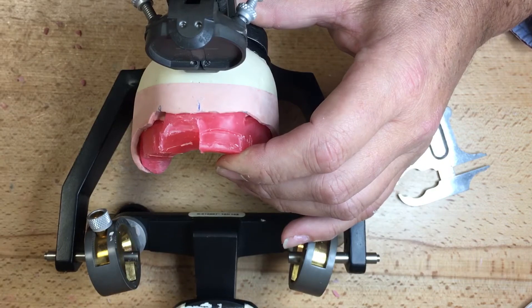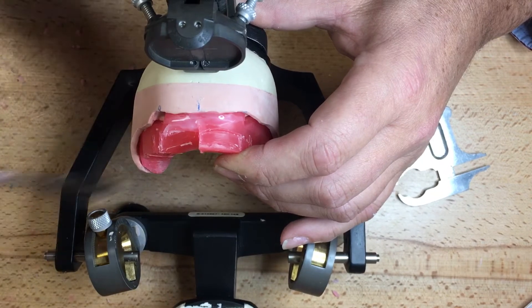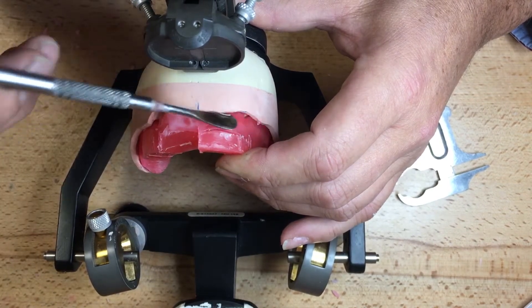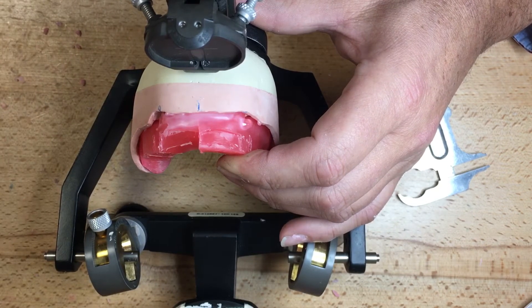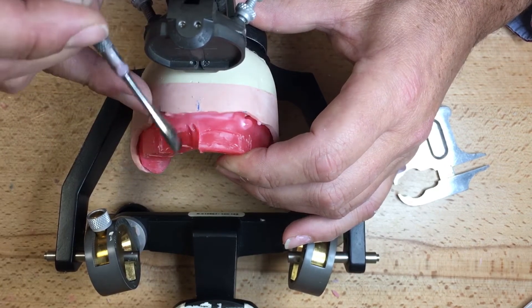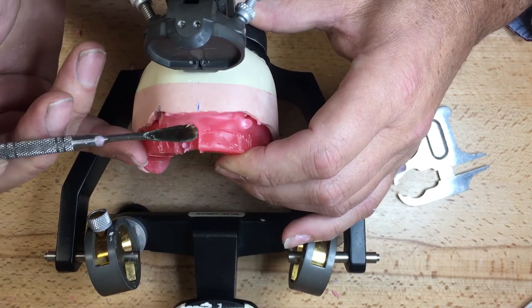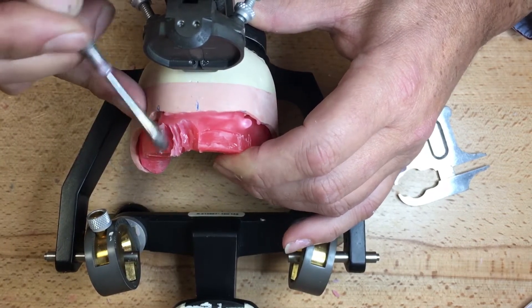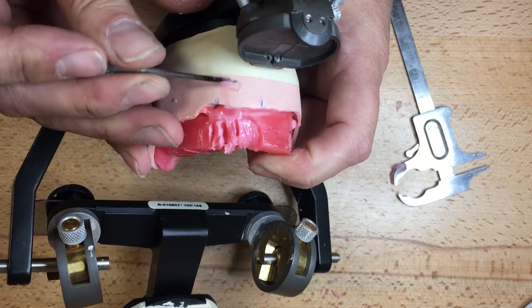I'm adhering the rim with wax. My model has been soaked in water prior to doing the setup. I have full anticipation that I'm going to finish in that instance, but in the event something comes up and you need to go back, re-soak the model, reseal the base down, and start as if you were starting from the beginning with the adherence of the wax to the model. I don't want the lower base or the lower occlusion rim to be moving around when I'm setting up the teeth — it needs to be in position.